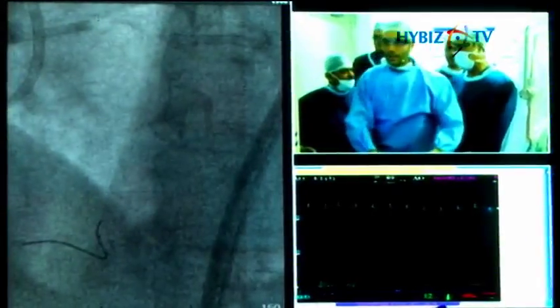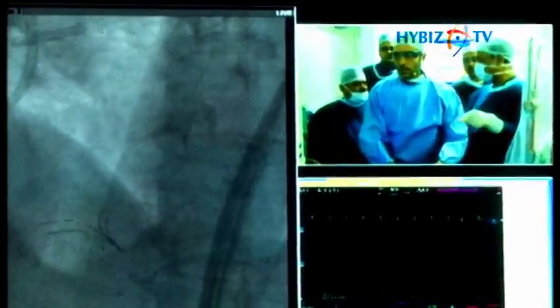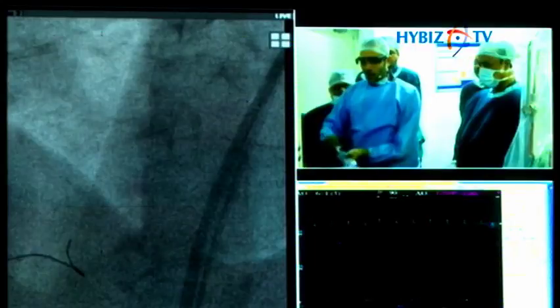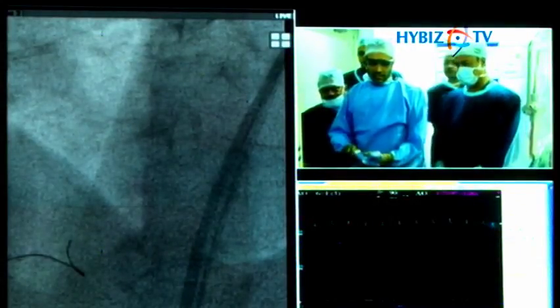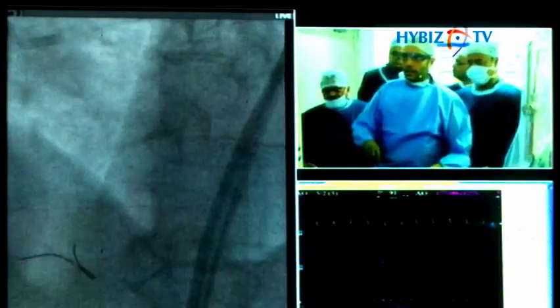It went through the lumen, this time. Can we go back to our cross bus? It went through the lumen, isn't it? Who knows where we went? I don't really know, but you are in the lumen in the end. It looks like it. So we're going to IVUS it, right? So we'll do that. Now, can we go back to Arun?